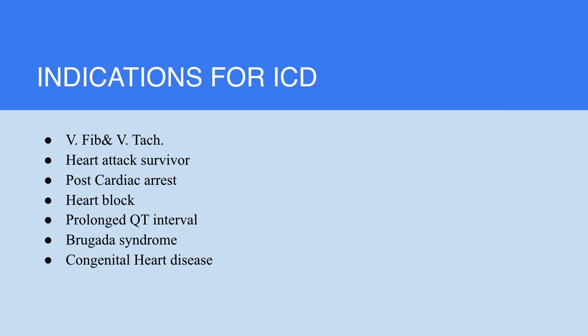What are the indications for ICD insertion? The first indication would be those who survive ventricular fibrillation and ventricular tachycardia. Patients who survived heart attacks and patients who are post-cardiac arrest status. Heart blocks, prolonged QT interval patients, patients with Brugada syndrome, and this is one of the syndromes that we are going to discuss later in the ECG syndromes lecture, and patients with congenital heart disease, cardiomyopathies are probably the most important ones.